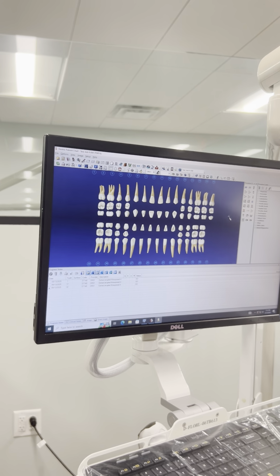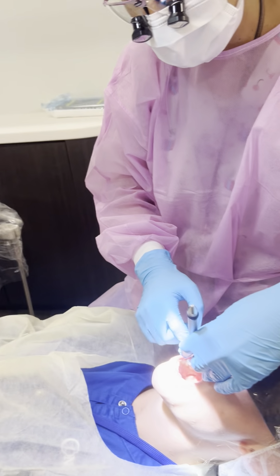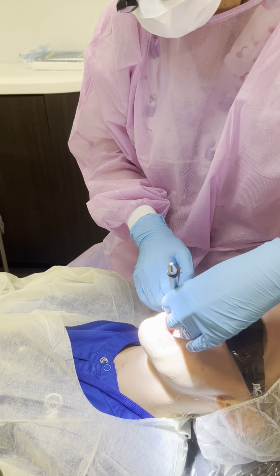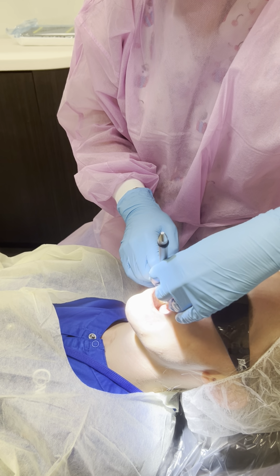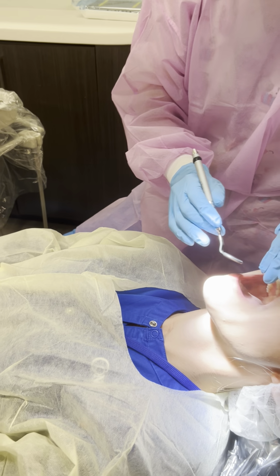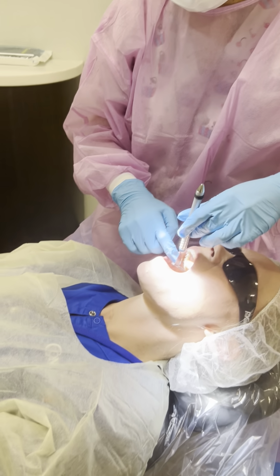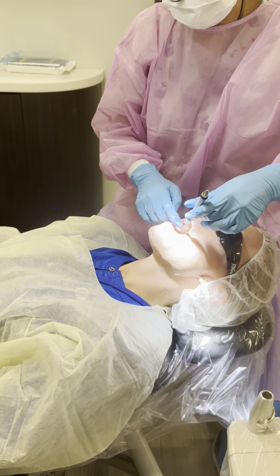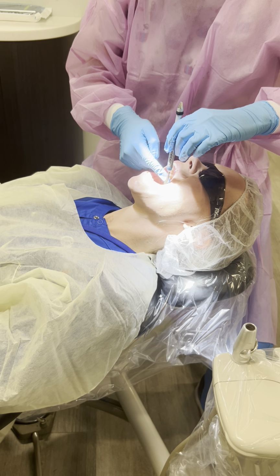Let's say she has a composite right here, number 3. It looks like an occlusal lingual. So I'm gonna look for other composites, little by little. I'm gonna have my air dry everywhere. That's another OL on 14 and also 15.